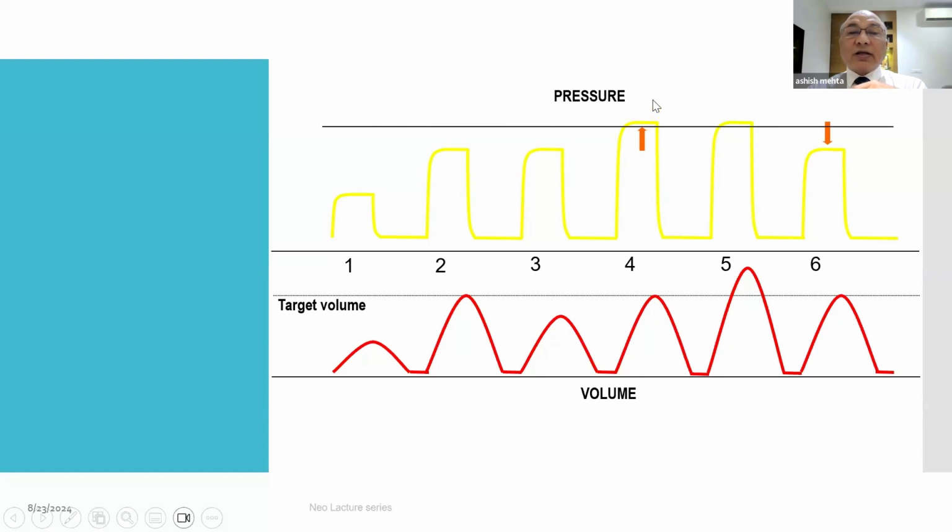Pmax will not automatically increase. It can decrease the pressure when the volume delivery is too high. Immediately on the next breath, less pressure will be delivered. But in a case where the lungs are getting worse or something has gone wrong with the baby, you need more pressure to deliver the targeted tidal volume. The machine will not give that extra pressure beyond Pmax. It says check the settings or low tidal volume delivery. Some message of this kind will be displayed.